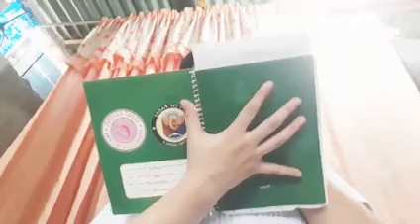Ma'am, are you having discomfort or any pain? Are you feeling any pain? Okay, you're alright. Thank you. So we're done. I will now discard this in the trash bin where it's properly disposed. And then I will now document the date and the time you inserted the IV fluid, the gauge and the brand name or type and length of the catheter, the number of attempts needed to insert, and what solution or drug the patient is receiving.